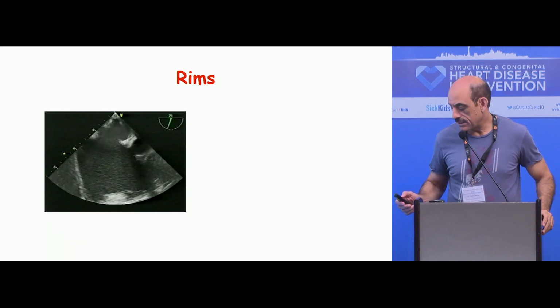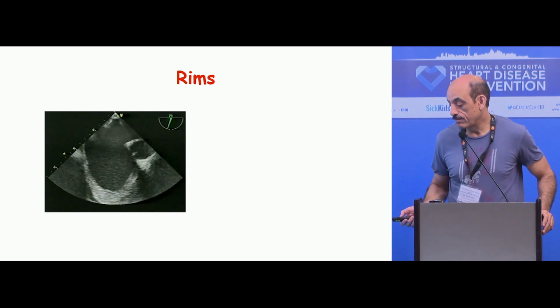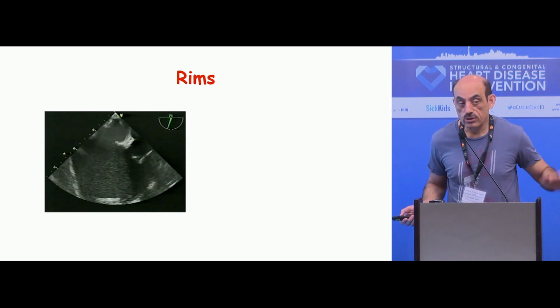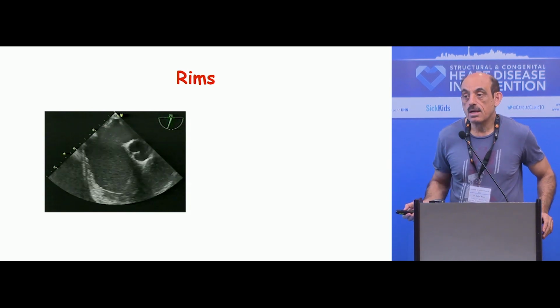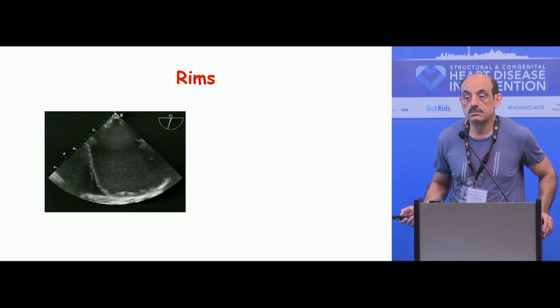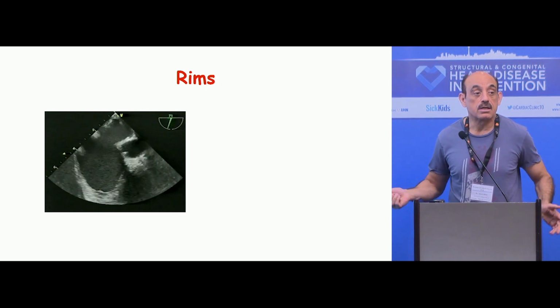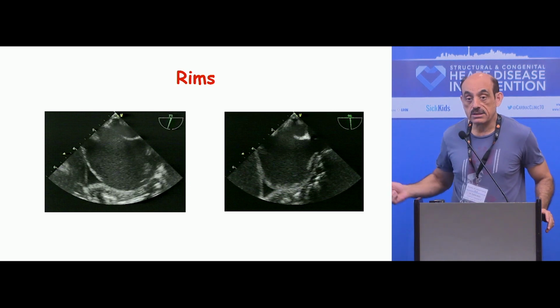Okay, so what's wrong with this atrial septal defect? Very quickly, I don't want to take a long time on this. What's wrong with this atrial septal defect? Should we close this case or this defect or no? I know you need more information, you can safely say that, but based upon this, what is wrong with this? So this, what is this? That's the posterior rim? Good, good. So that is definitely not the posterior rim because this patient doesn't have any posterior rim. It's way up there. It's completely missing. And this is exactly when you go to real bicaval view, even IVC rim is completely missing in this particular patient.